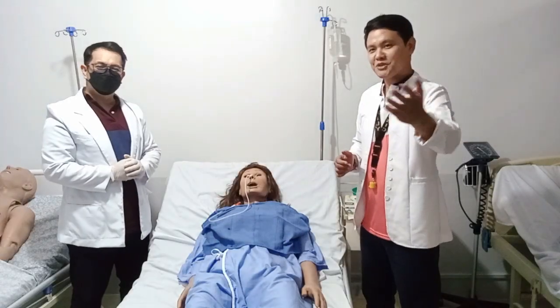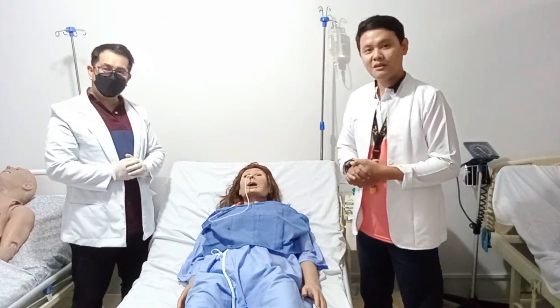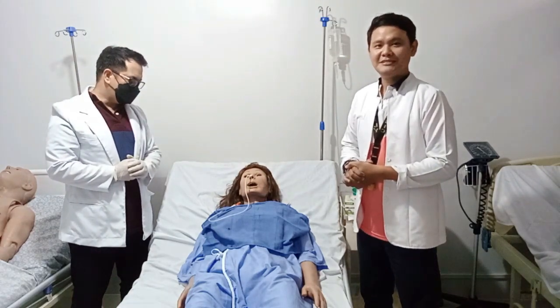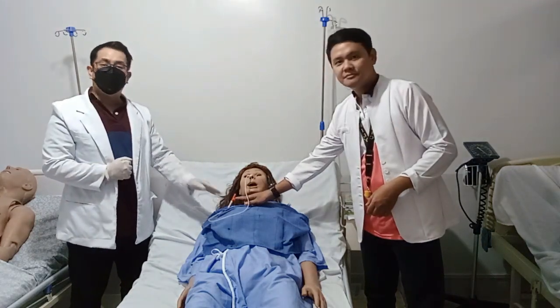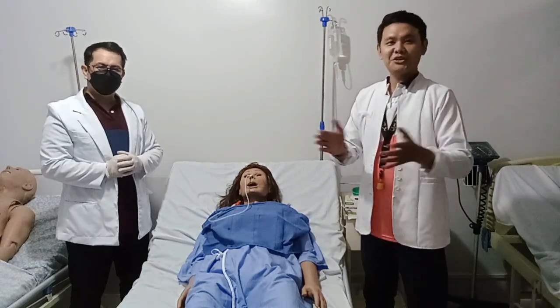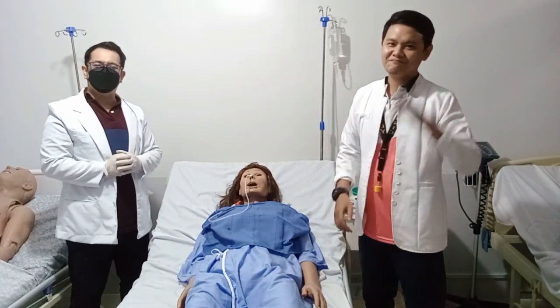I would just like to remind everybody that after properly inserting the NGT tube, you have to properly secure it to the patient's gown. And that concludes our NGT insertion. I'm Johnny Balmeo, and I'm Froil Angelosa. Looking forward to your return demonstration.